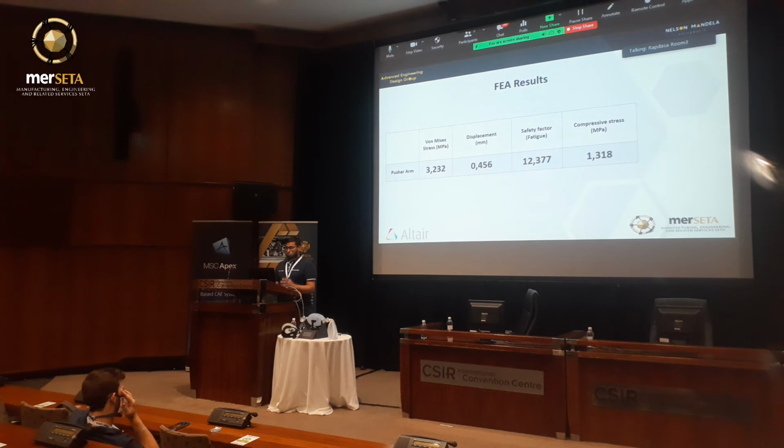The data extracted from our FEA results are tabulated in the table above. The pusher arms have a small deflection of 0.456 millimeters off the original position. Now, deflection on our pusher arms is not a desirable property, because if our pusher arms deflect, that means that our pusher arms are not operating most efficiently. Therefore, a more rigid structure is desirable. Nonetheless, the deflection will never occur continuously in everyday motion, as we have programmed the system to never operate at the worst case loading scenario.